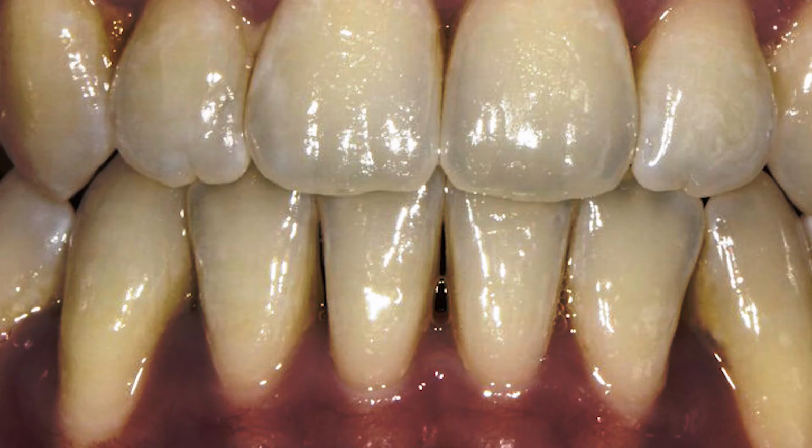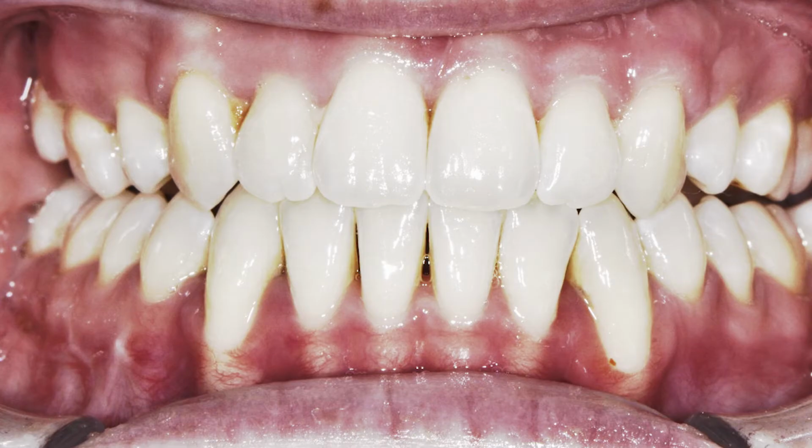Now, if it doesn't take a perfect image, it means that there's something that's happening that's confusing the camera. Either gingiva's too dark, there's too much teeth, maybe the patient's whitening their teeth too much, and you might have to go to manual settings. Now, if you want to learn more about manual settings, like I said, look at my video that I've posted previously.